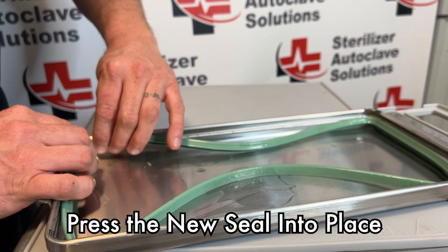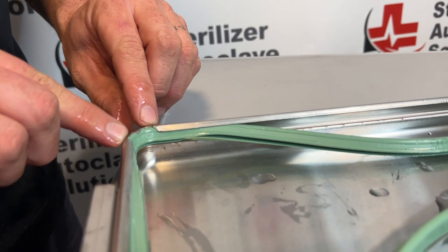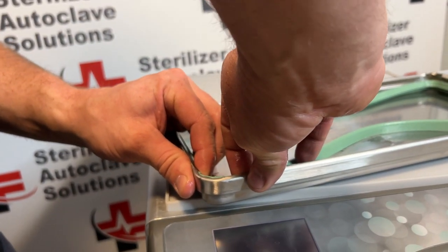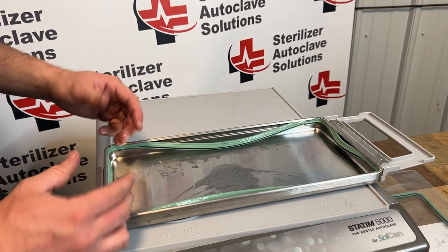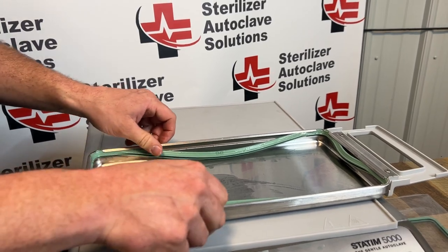Starting at one of the corners I'm just going to pop that in, and you want to make sure these nubs are touching on either side. We're going to do that on all four corners. Once you have the corners in it should look something like this. Next I'm going to come to my short sides and pop that in.